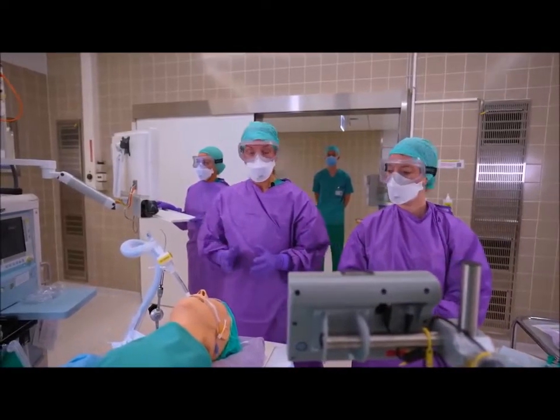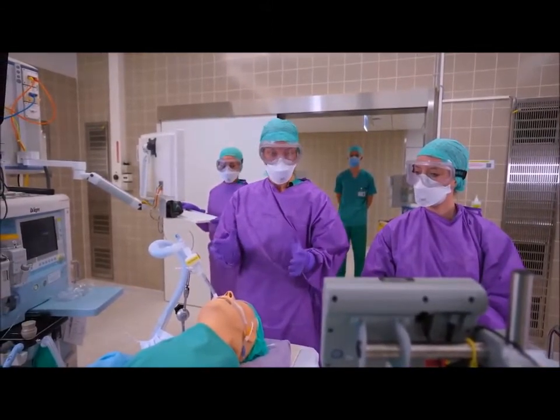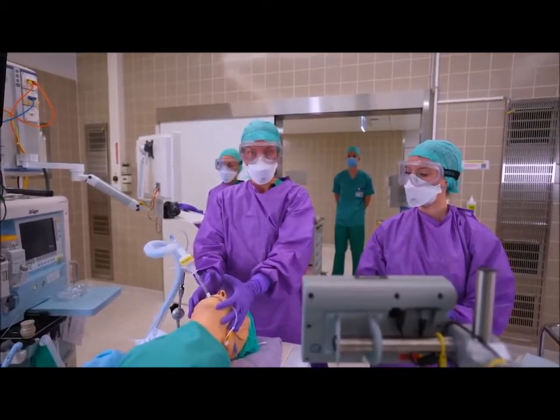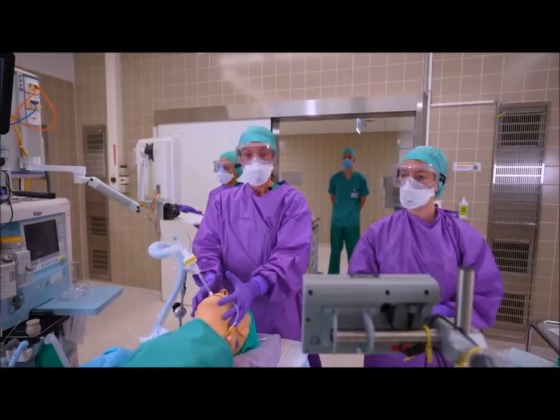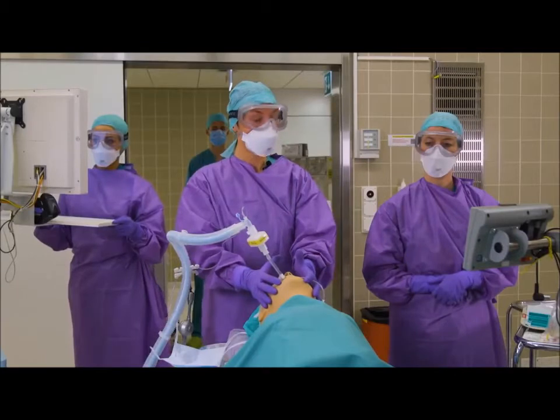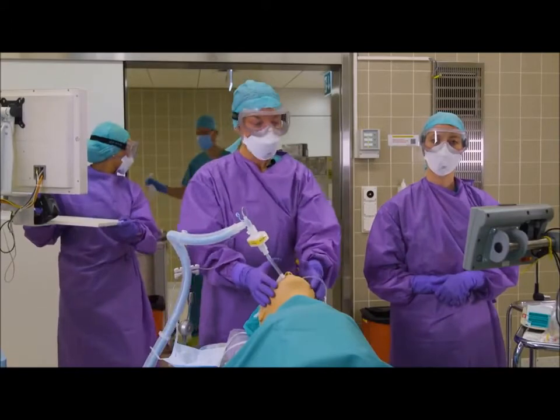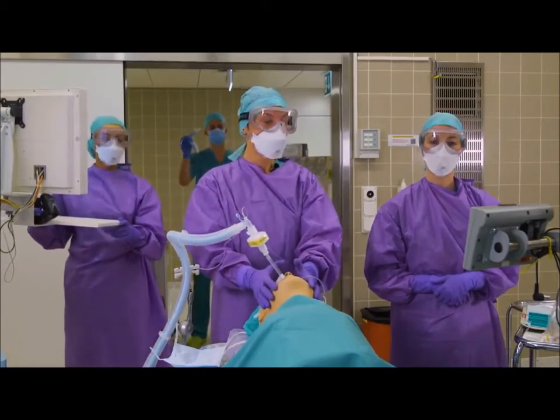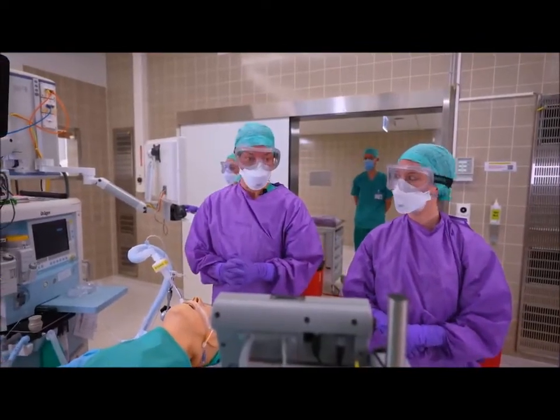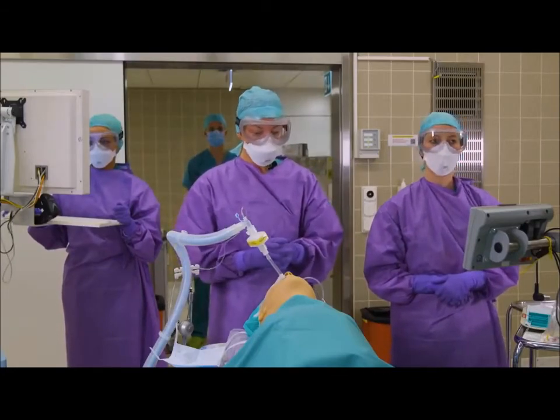If a patient is desaturating and you have to bag-mask the patient, it is very important to use both hands to have a tight seal, and have a second person, Larissa in this case, to bag-mask your patient. If the bag-masking is not successful, it is important to then reach out to the person outside the room and gather other aids. For example, LMA. If you have to escalate to a fiber optic scope, please use a single-use fibroscope.